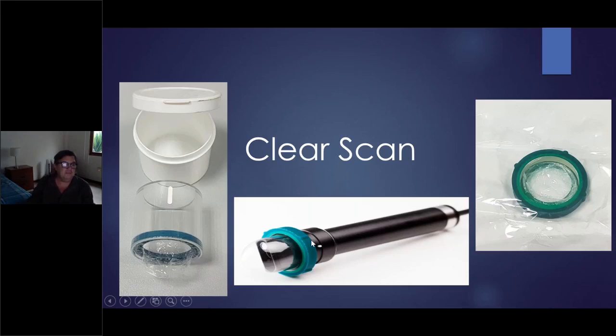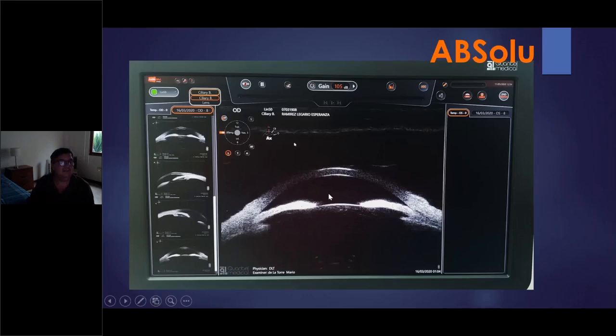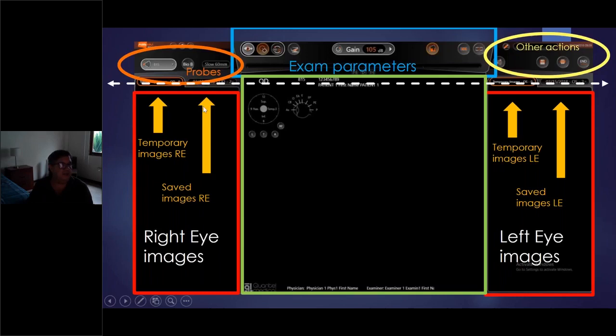Please, I don't know what happens with the electrical power in your country, but in mine, I should protect my machine using this unit in order to avoid power peaks. The screen is very nice. You can see everything here. You can see the right eye. Let's see what happens. The upper part is the navigation tool and exam parameters, the probes, the temporary images of the right eye, the saved images, which is also another action here. This is very nice to see.